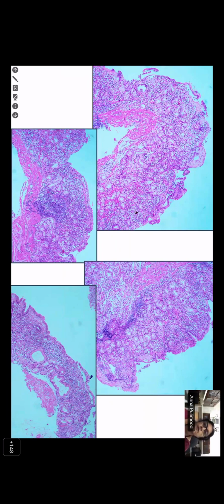Okay, good. So you're saying there's inflammation. Is there any atrophy? What about this gap? Yes, ma'am. There's a gap here, right? Yes, ma'am, a gap in between. Some atrophy. Okay. What about these things? What are these?